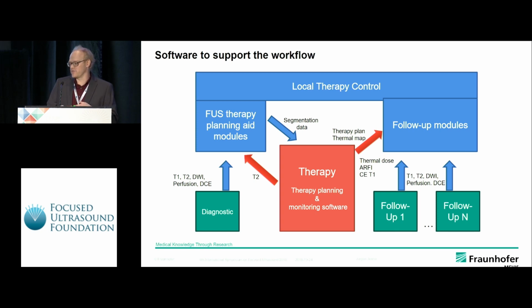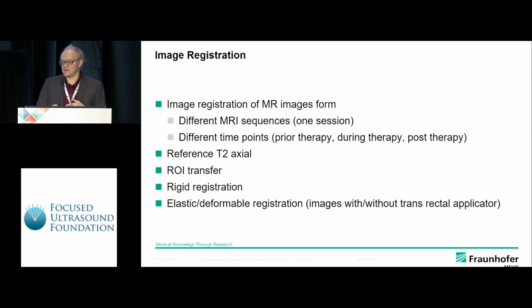We have, for example, the thermal dose or the thermometry, and all this information should be available within the follow-up process, maybe to decide is this a scar or a recurrent cancer. And a very important tool here is image registration with different MRI sequences at one session, and image registration for MRI examinations at different time points.